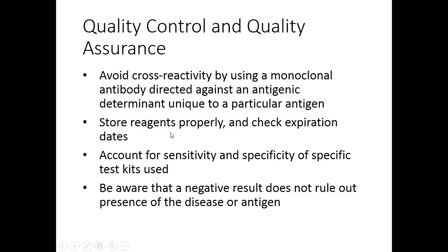Always make sure the immune reagents are highly sensitive to temperature and improper storage, so make sure you store the reagents properly. Make sure you get a sensitivity and specificity test kit that's going to be sufficient for what we're looking for. And remember, a negative result doesn't always rule out the presence of disease or antigen.